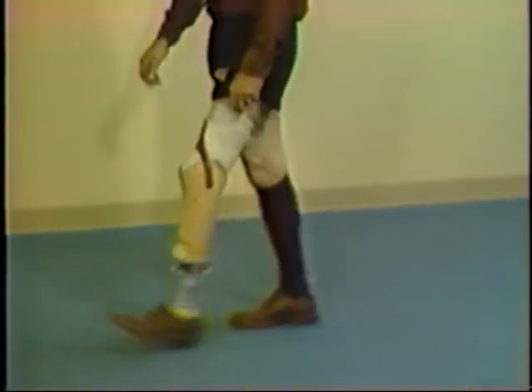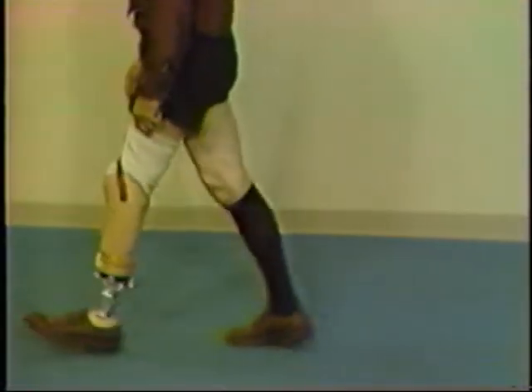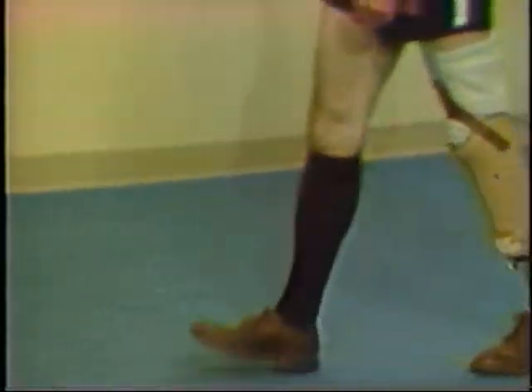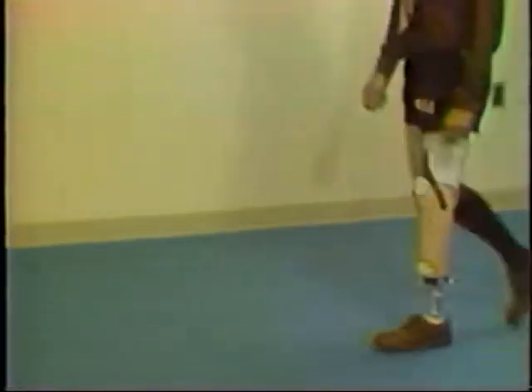The second perspective you must use to complete the dynamic alignment is from the side angle. Again, observe the interaction of the socket, pylon, and foot.